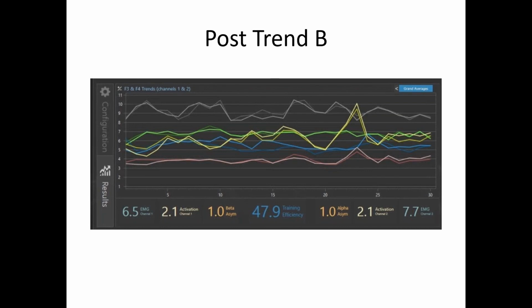No, it does not harm. What you're doing is you're not enforcing, but encouraging, inviting, teasing the brain to keep the good performance up. And that can be very, very helpful too in many aspects you don't even look at. So you don't really need to change as soon as a brain is somewhere where you assume it should be. Just let that brain play the Rubik's Cube.